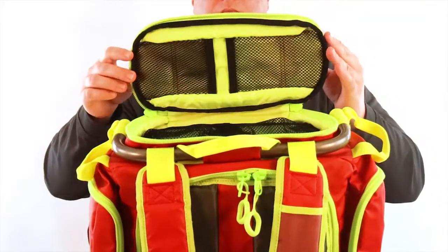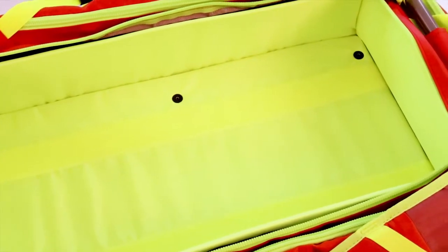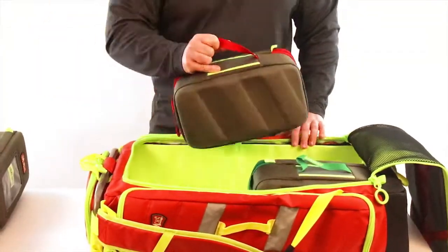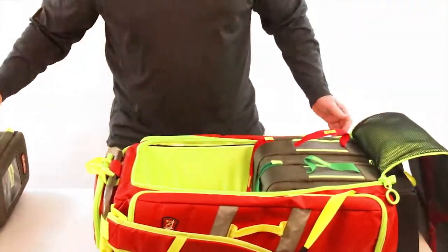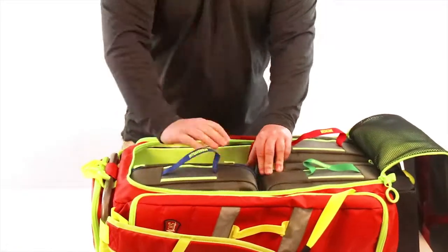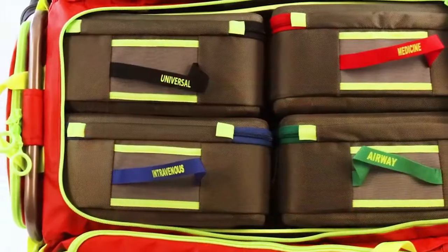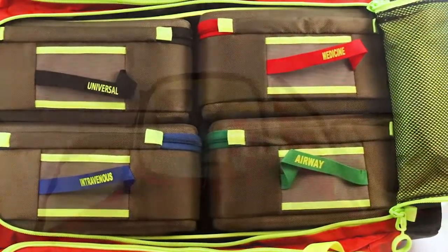As we open the main compartment, we are greeted with a large Velcro-lined storage area with several different customizable options. Up to four G3 medical cells will fit in this bag, keeping needed equipment easily identifiable, organized, and tidy.